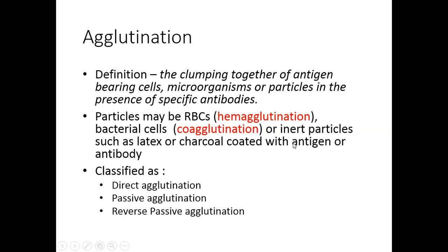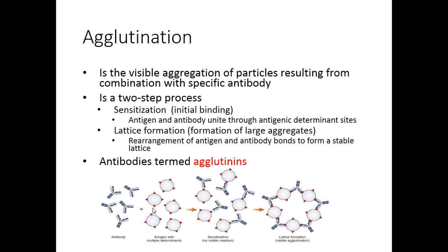And these agglutination tests, there's more than this. We can classify it as direct, passive, reverse passive, as well as a couple other agglutination reactions. We're going to talk about agglutination inhibitors as well, but they're not. These are the classifications that I want to talk about.